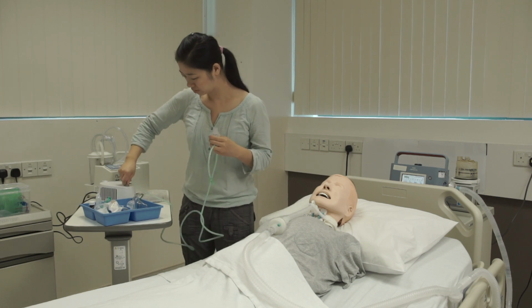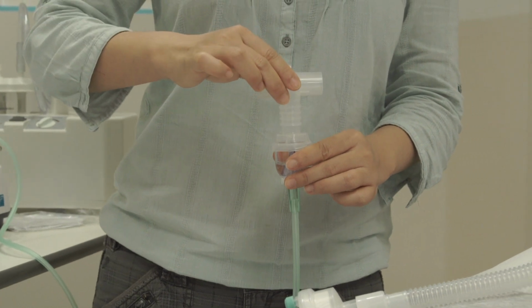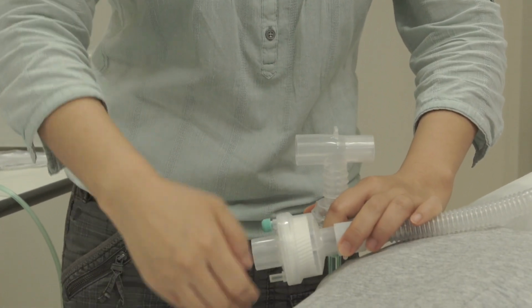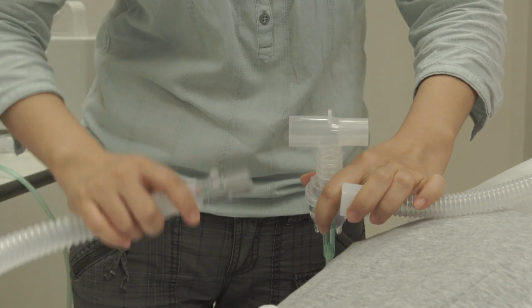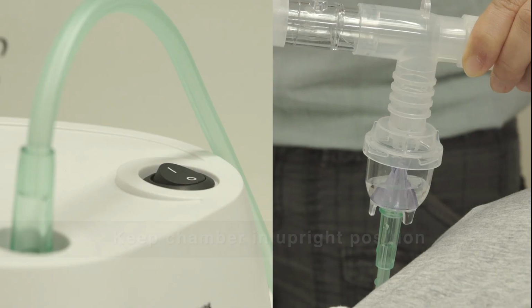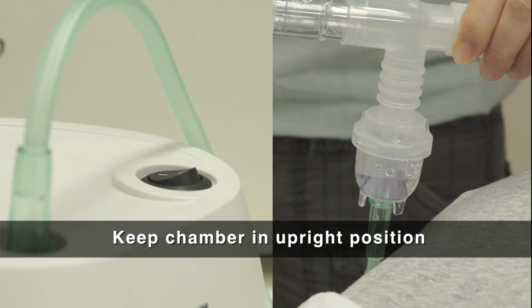Connect the tube from the nebulizer machine to the nebulizer chamber tip. Connect the nebulizer chamber to the T connector. Remove the HME and put the T connector with the chamber in the circuit. Switch on the machine and keep the chamber in an upright position to prevent spillage.